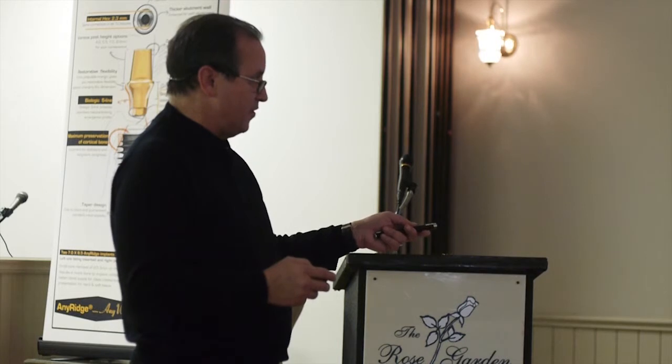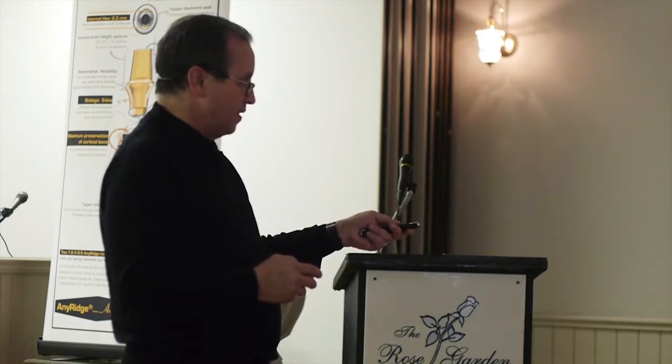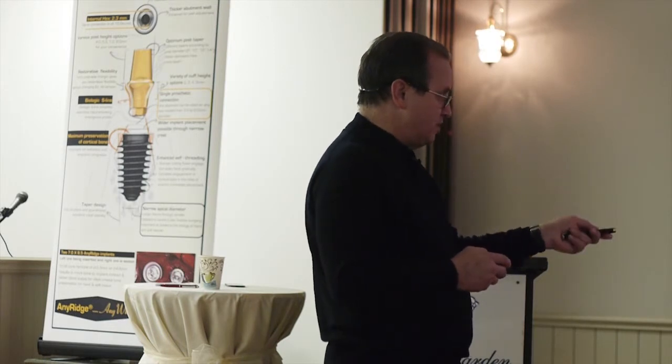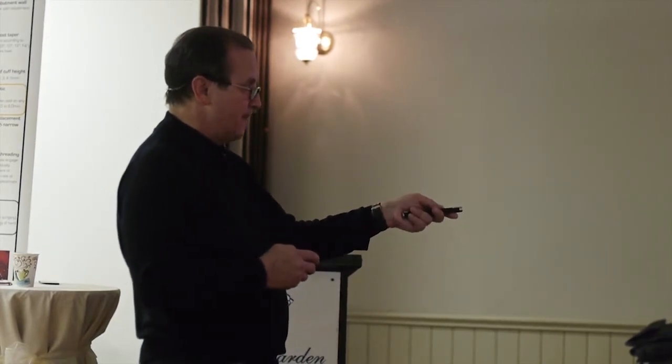So we're thinking about, we take both of these teeth out, flap, and debride that big void really, really well. Here's an implant in the number 8 position. This is number 9. That's a mini implant. And number 10, we put the implant in with the graft, but we're not going to load this. Okay? There's just too much happening up there.